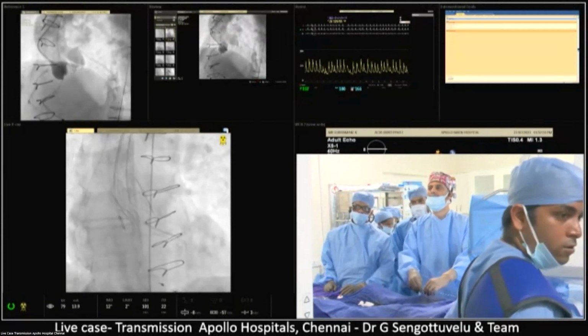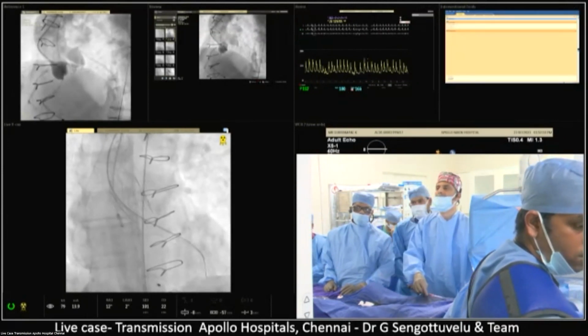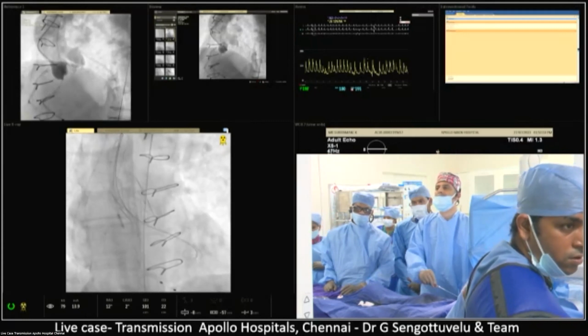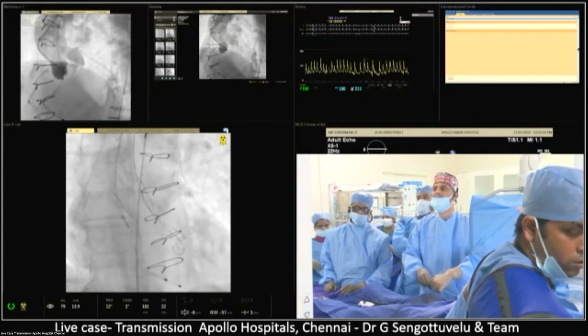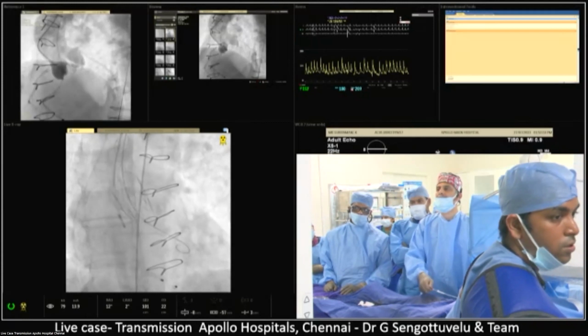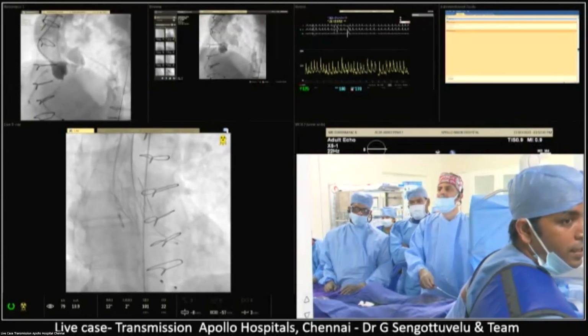My suggestion is to use some other balloon expandable, either a Sapien or a MyVal, because I would not suggest a second Neo. I was part of this Accurate trial in the US, and I know the challenges with this valve. But in India, I think the cost implication will be big because it's two different companies. If you put a MyVal in this already Accurate, then it doubles the cost.